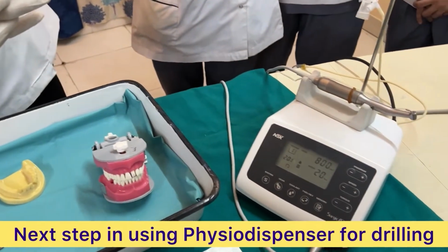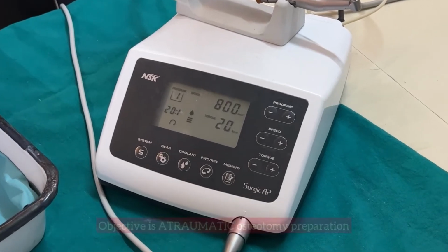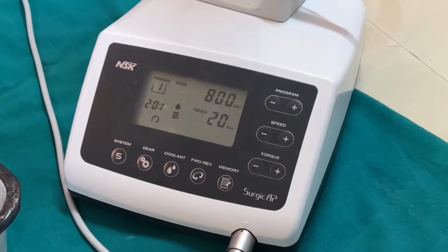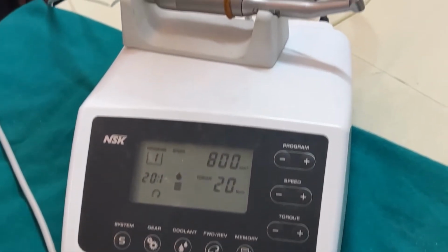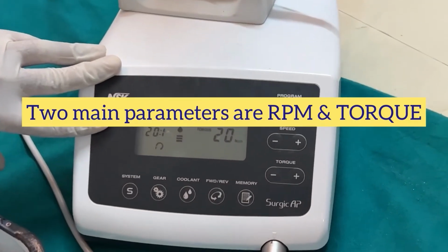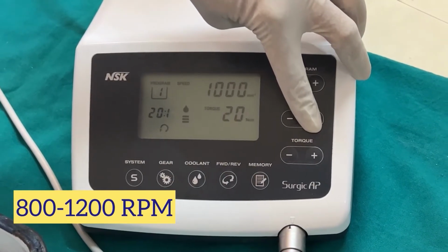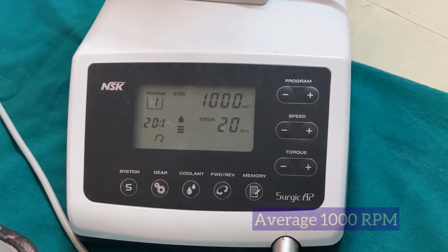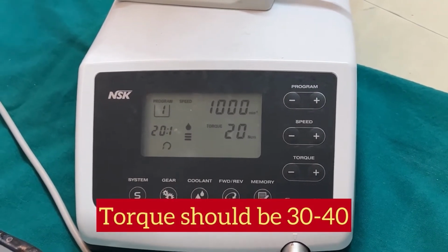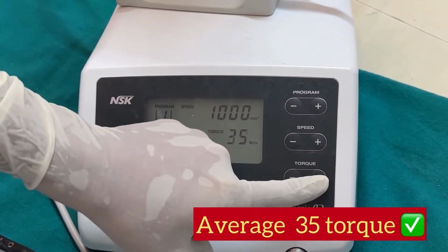As covered in the earlier video, this is the apparatus that we need to use, because ultimately the objective is atraumatic osteotomy preparation. Only then will your implant survive in the long term. Normally the two parameters which you set are RPM and torque. RPM roughly 800, maximum 1200. On an average we take 1000 RPM. And torque, the rotating force, should be 30 to 40. On an average we can take it as 35.